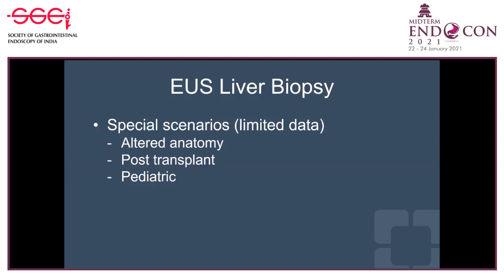So obviously it's doable because regardless patient have Roux-en-Y gastric bypass or Whipple, we can always see the left lobe of the liver. Post-liver transplant is a little bit of a tricky population. At our institution, still the standard of care for post-transplant evaluation for abnormal LFT to rule out rejection is percutaneous biopsy. We are trying to persuade our liver surgeons, but there are just a couple small series that showed safety and efficacy. Similarly, there are a few case reports showing safety and efficacy of EUS guided liver biopsy using 19 gauge needle in pediatric population.